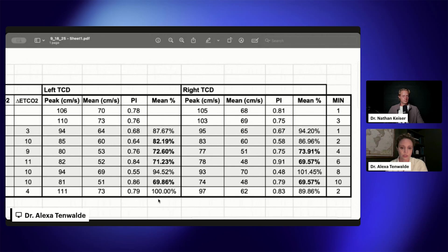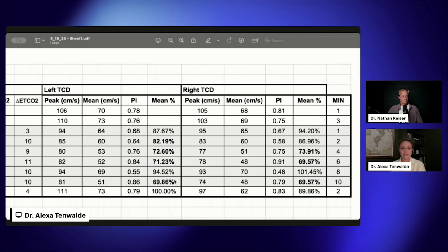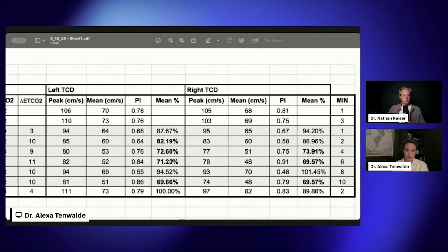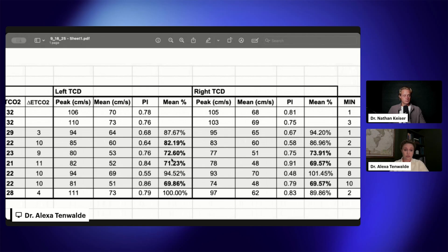On this initial exam, these two columns we're really looking at here: the mean percentage change that we see when we go upright against gravity into orthostasis. We want these numbers to remain ideally above 85 percent. We can see these bolded numbers here—she did not quite maintain that on her first tilt. As we're measuring minute by minute, we can see there's quite a bit of fatigability. She's dropping down into the 70s, down to a 69 down here.